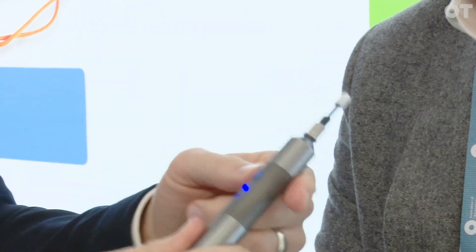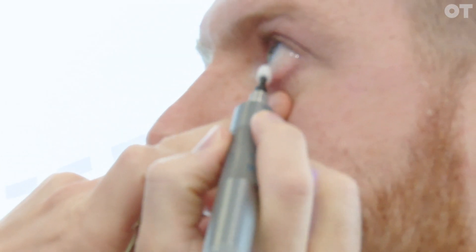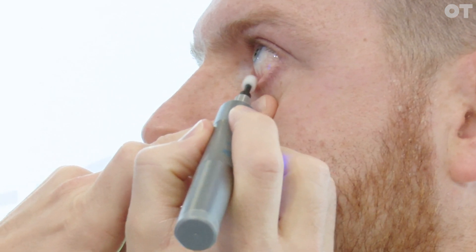It's got two settings — it's spinning clockwise and anti-clockwise. I'll just pull down the lower lid and you can see it's fairly non-invasive. The patient's not screaming in agony or anything like that.